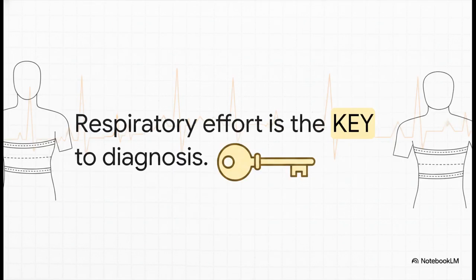But honestly, if you take away absolutely nothing else from this section, please let it be this golden rule. Respiratory effort is the absolute key to your diagnosis. Seriously. Whether the patient's chest and belly are physically trying to breathe, whether that effort is present or completely absent, is the ultimate deciding factor in how we classify every single one of these events. Just keep that tucked in your back pocket as we go.